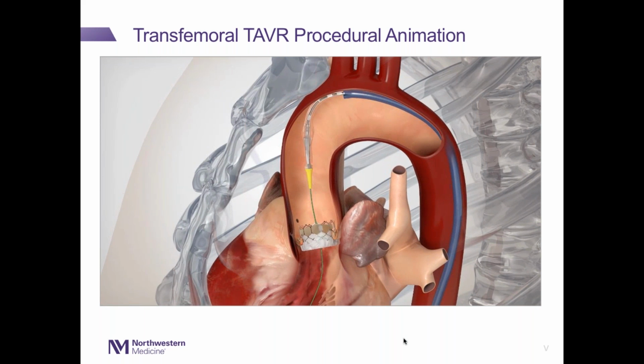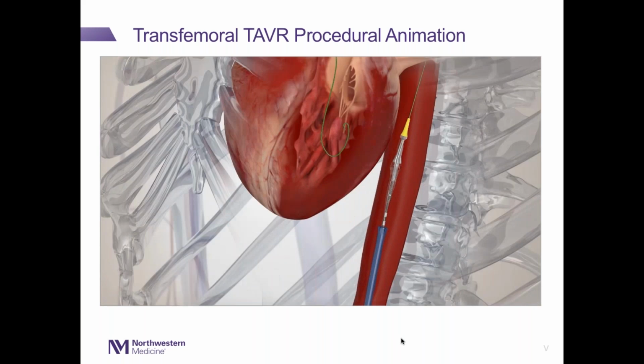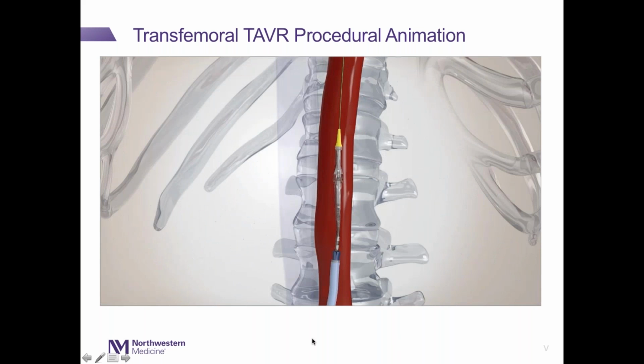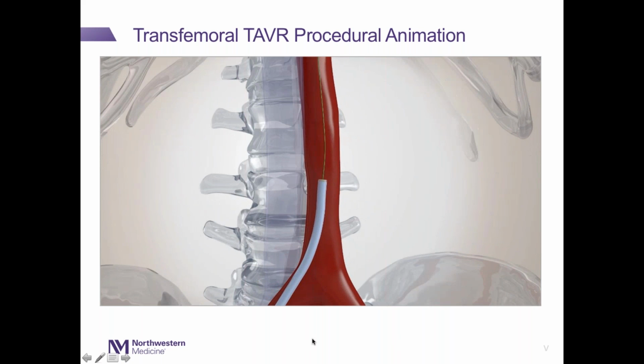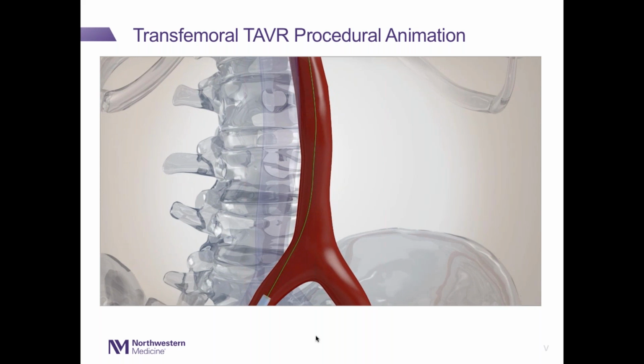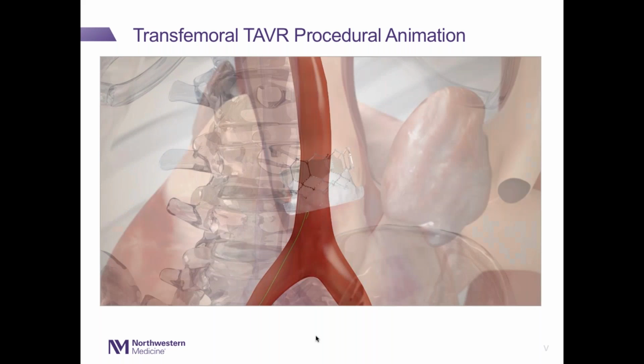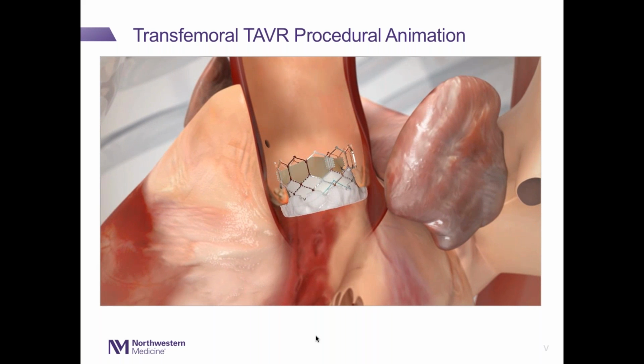At Northwestern, we do most of our patients today with conscious sedation. They don't even require general anesthesia anymore. It's done in collaboration with cardiac surgery and interventional cardiology. We do all of these together, and we've done over 600 of these now with excellent outcomes, and even more importantly, with great collaboration among the specialties, trying to design the best therapy for the patients.